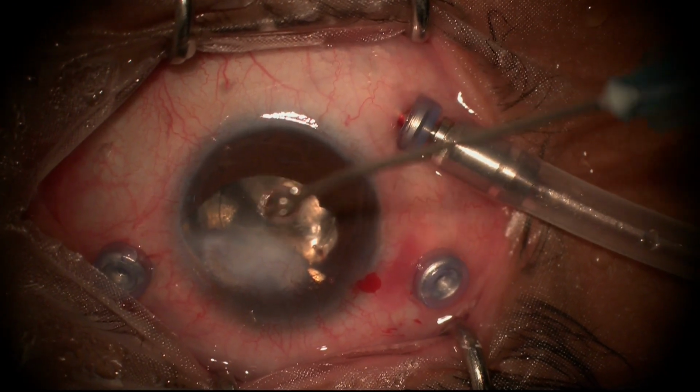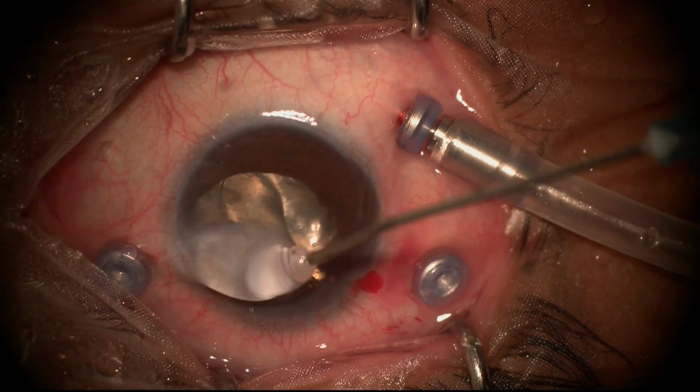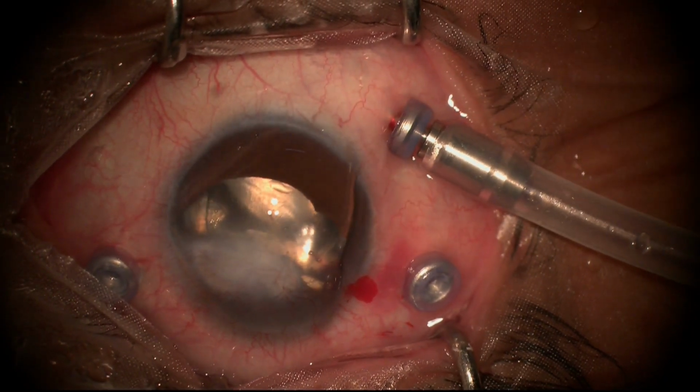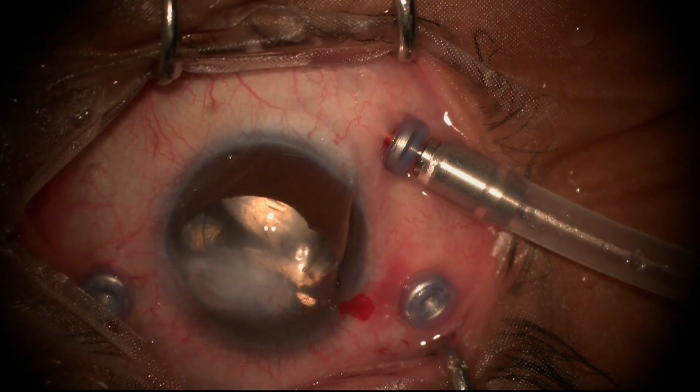For example, now we have left behind visco in the anterior chamber. Even that is going to be a problem next day. So we need to wash it away.